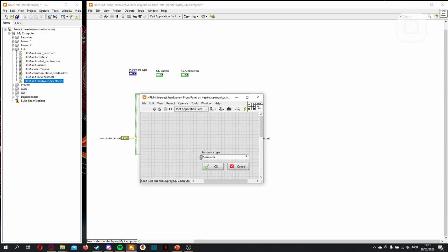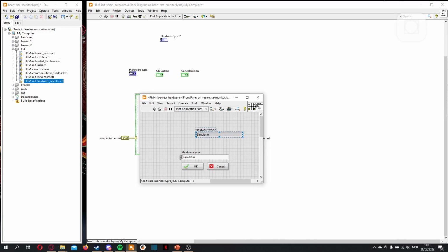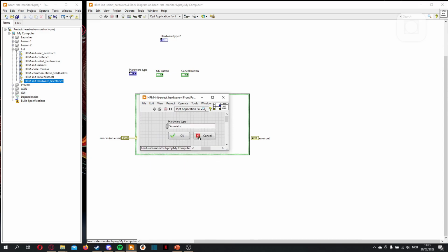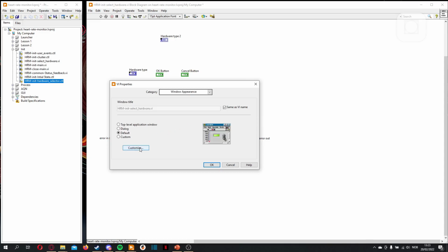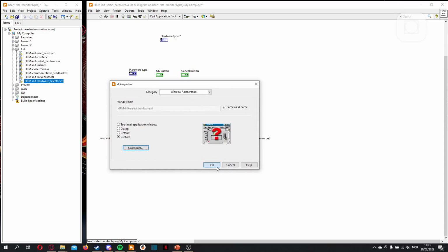We want to pass this data out, so what we can do is to create another one, change it to indicator, and say this is the output. So we want this one to pop up, and then it sends out the output. We don't want to see the output, so we can just hide it. For this guy to pop up, we need to go into the properties, go into Windows Appearance, and then you could just choose top level, which is nice to choose anyway, but then don't show front panel when loaded, because this is just annoying. There you go.